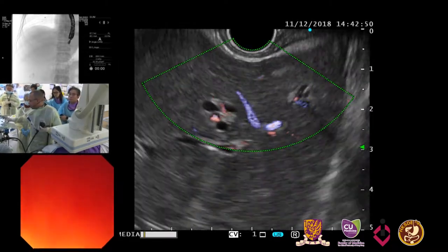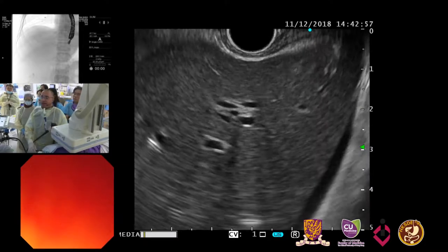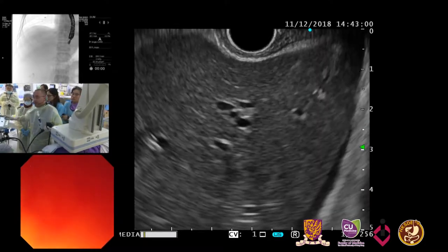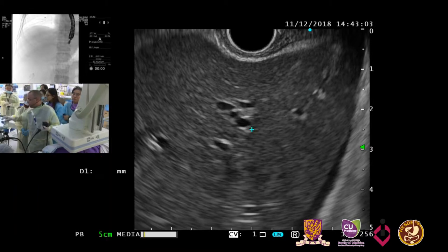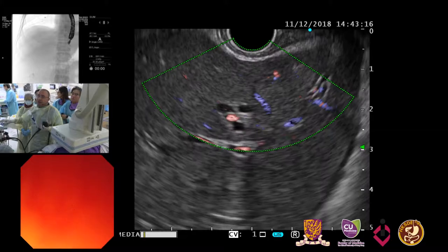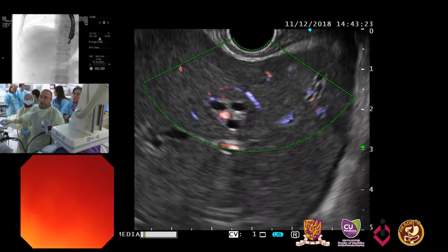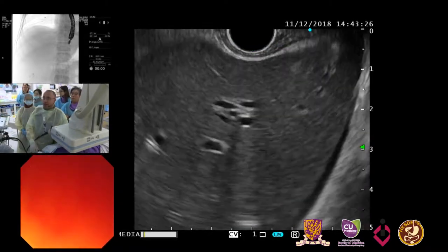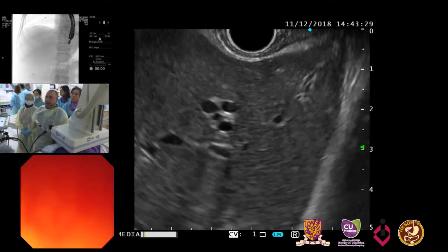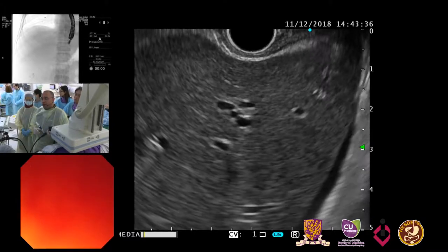So it's not that dilated, so we were not impressed, but that's the only access we have in this patient. The distance of this duct to the surface of the liver is good. So it's about 1.5 centimeter. We like it to be within 3 centimeters, so that's good. We don't have large vessels in the way. There are vessels always in this area that run with the duct, of course, but I think it's acceptable. So the mildly dilated duct in a jaundiced patient, and we looked around for other methods of drainage. That was the only route.